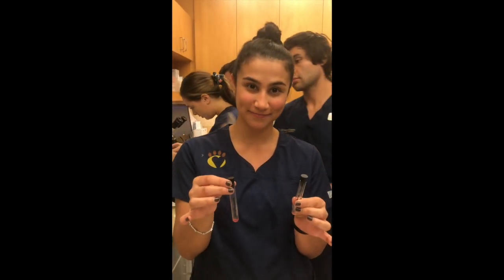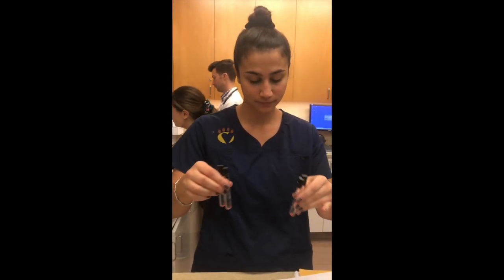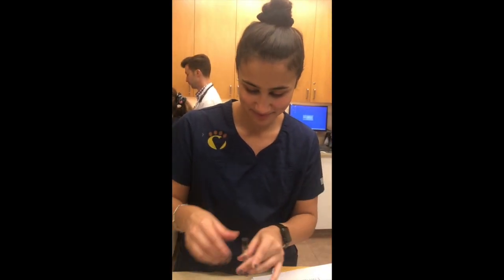And now we have our donor and our recipient controls. Okay, so now we have all 4 of our tubes. I'm just gently going to mix them. Great. Now I'm going to put all 4 tubes in our stand at room temperature and let them sit for 30 minutes.